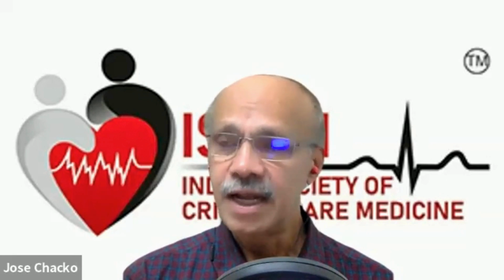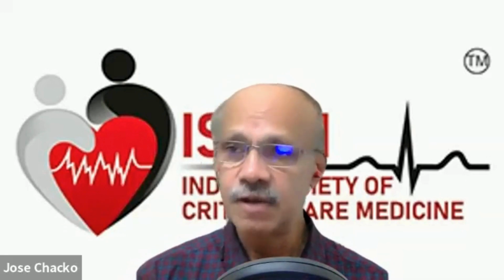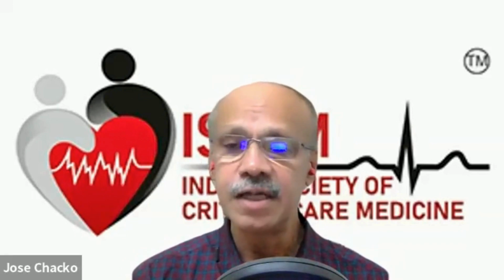Look at the lungs, look at the aeration score at baseline and as you go every few hours. And you can actually tell, based on direct visualization, whether the lungs are actually improving with your diuretic therapy or not. Of course, it will reflect as improved oxygenation as well. You may be able to come down on the ventilation.